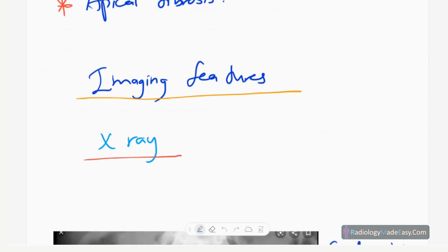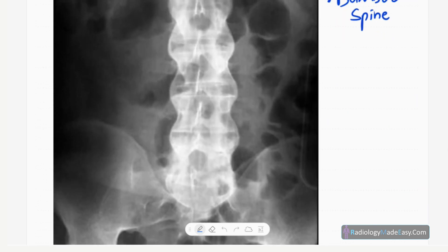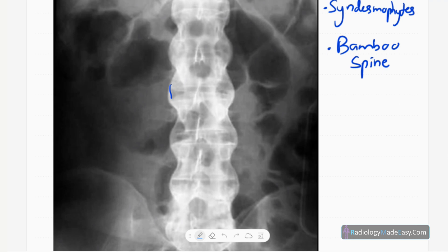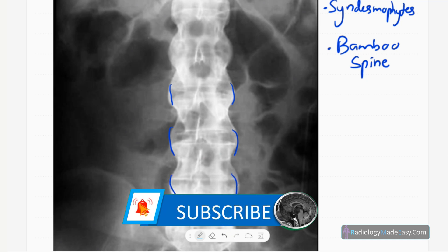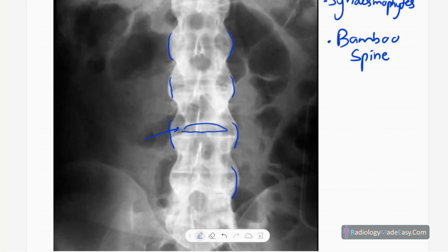First, looking at X-rays of the lumbar spine and sacroiliac joints in an advanced patient. You can see fusion of the vertebral bodies with syndesmophyte formation — ossification of the annulus fibrosus of the intervertebral disc leading to fusion of the vertebral bodies. The main finding is fusion of the vertebral bodies.